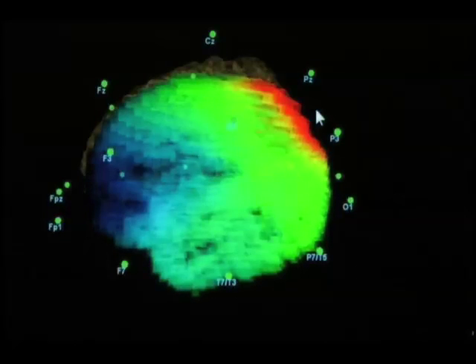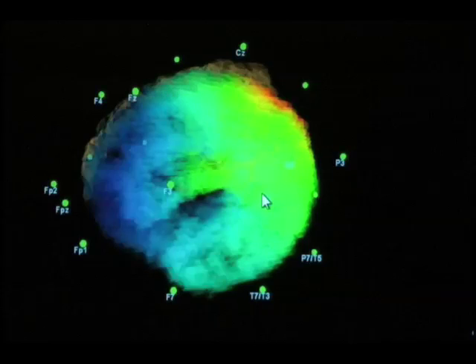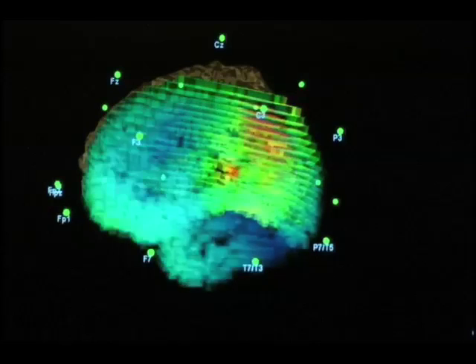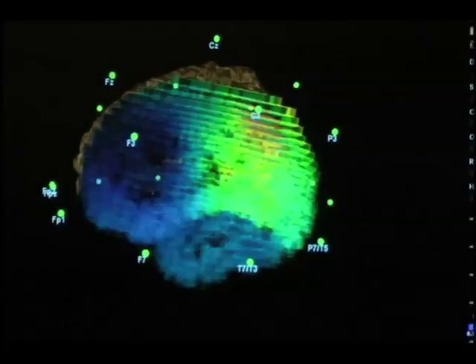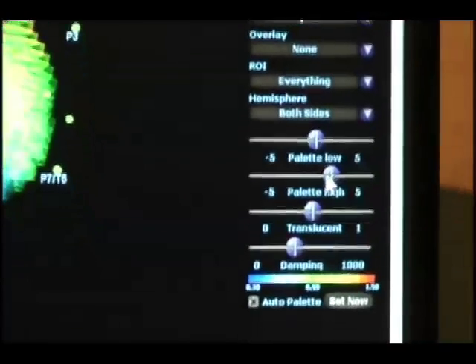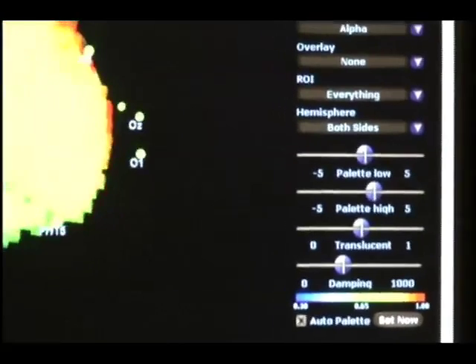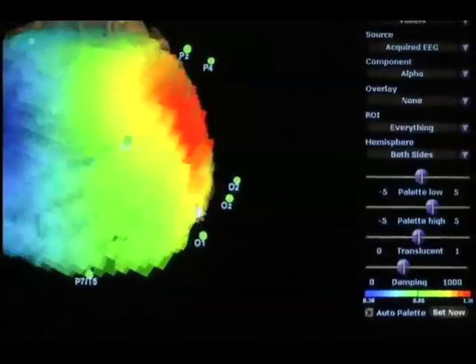The question we have to answer is exactly what do we mean when we say not much or a lot. This touches on the idea of Z scores and normative ranges, but this is more of a display issue. We have a value called palette low, the value of the current source density that we decide will be black. Then we have one called palette high, the value that will be red, the top of the distribution.